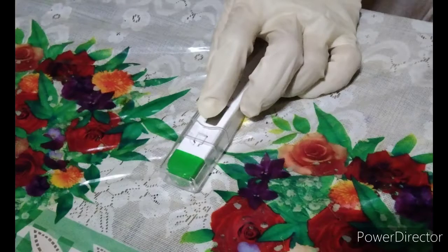Measure pH of aspirated GI contents. Imagine this is our measuring pH. Fasting gastric pH is usually equal to or less than 4. It is only infrequently greater than 6. In contrast, intestinal aspirates usually have a pH equal to or greater than 7.